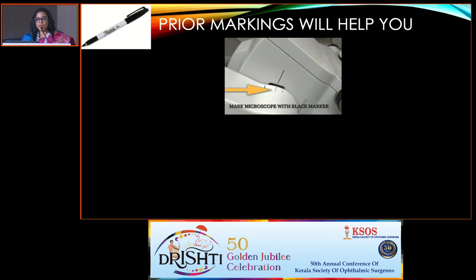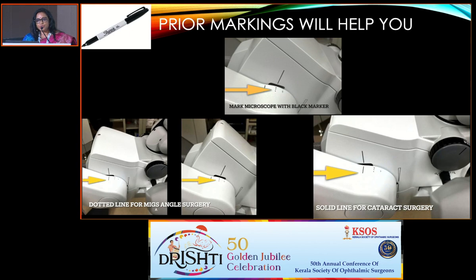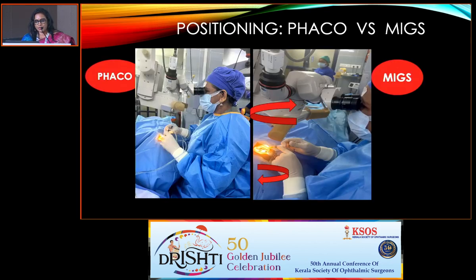So now you know how much to tilt, you mark it and keep it, so that repeatedly you needn't keep on tilting to various levels. So you can have a marked one that you can use when you have a gonio procedure, you can tilt it to the preset marks.